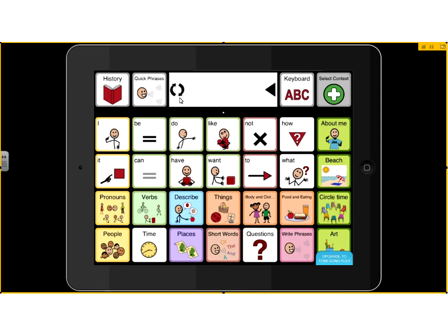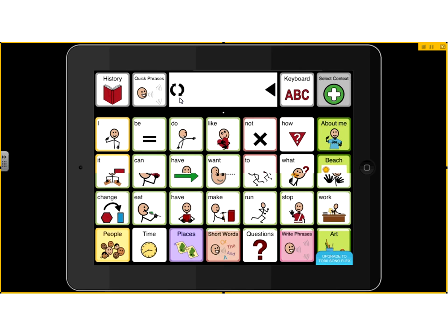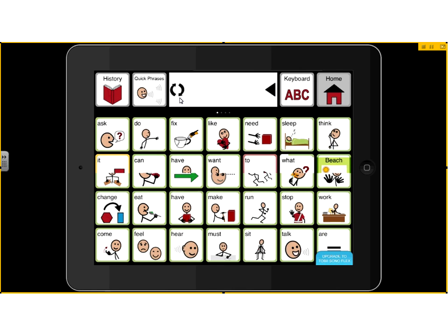So that conjugation thing is a really cool component. Instead of having four different things for play bogging down the verbs area, we've got the conjugation button that we can hit, and then have access to different forms of that word.